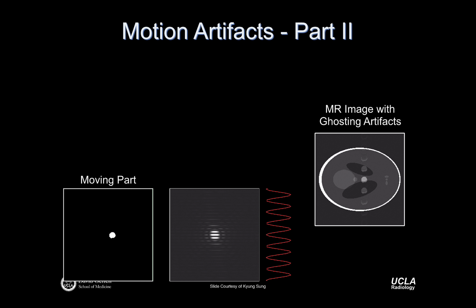So if my TR was picoseconds, right, then I would just zip through K-space, and I would just capture this object in one of its states, and it would have the right orientation and the accordant intensity in the object without this sort of artifacting. But because my acquisition itself is relatively slow, and it's slow on the same time scale of our heartbeat, then we get these banding patterns. If I zip through K-space really quickly, then the periodicity between these things gets farther and farther apart until it's gone. Right?